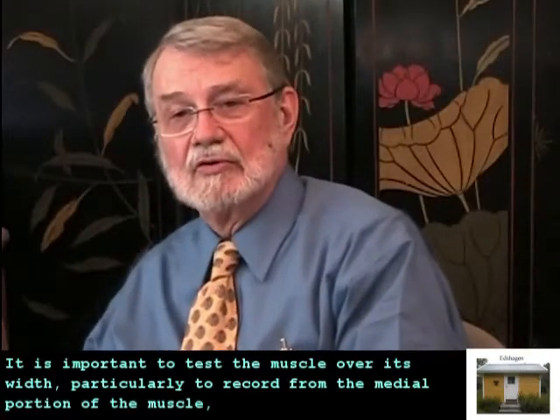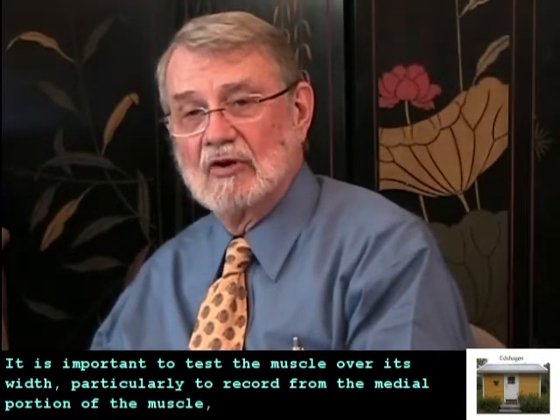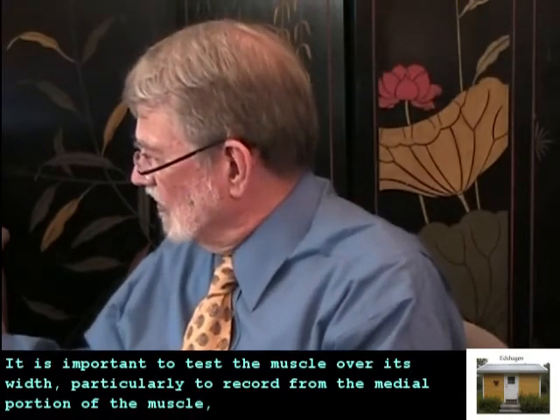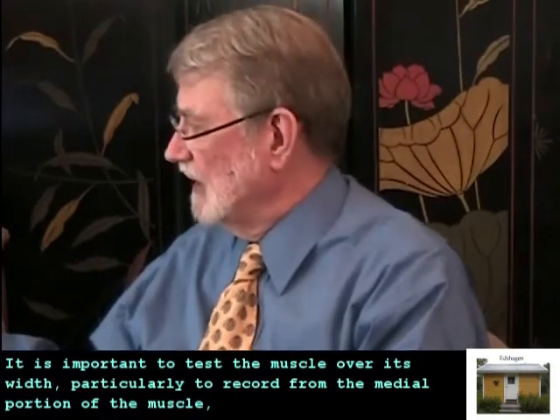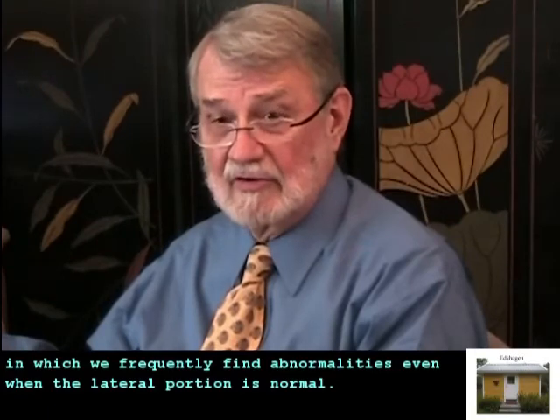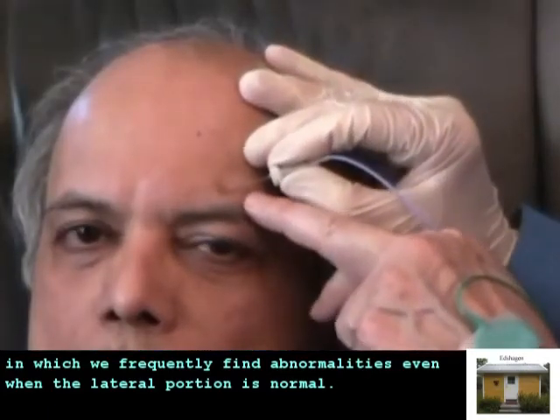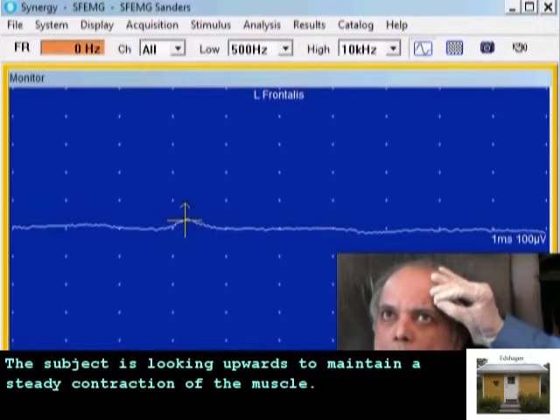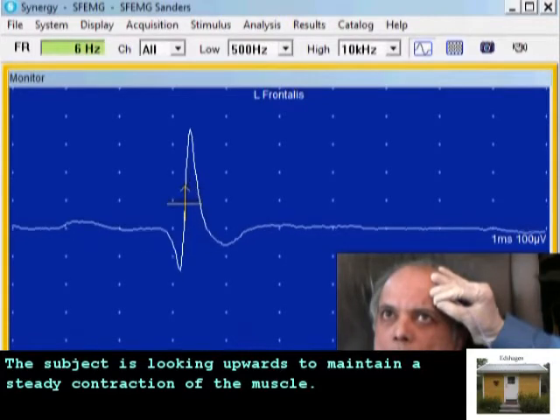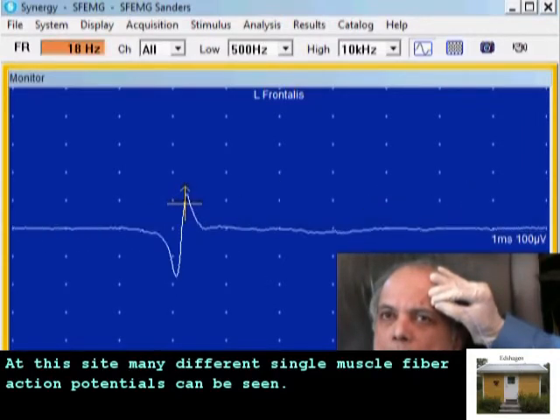It's important to test the muscle over its width, particularly to record from the medial portion of the muscle, in which we frequently find abnormalities even when the lateral portion is normal. The subject is looking upwards to maintain a steady contraction of the muscle, and at this site many different single muscle fiber action potentials can be seen.